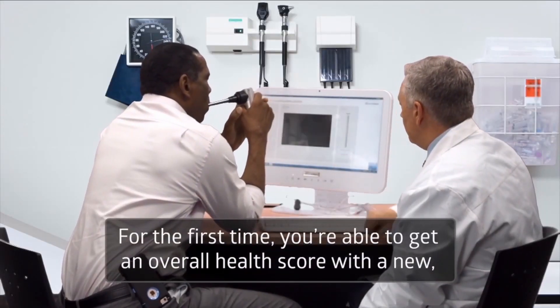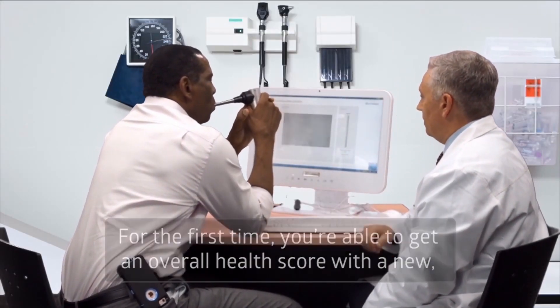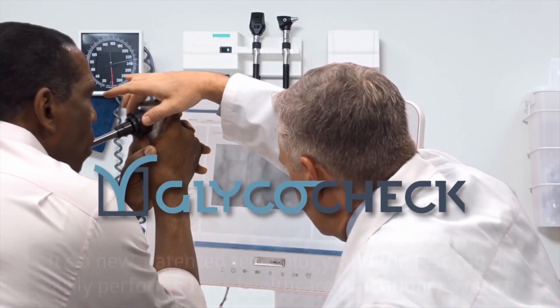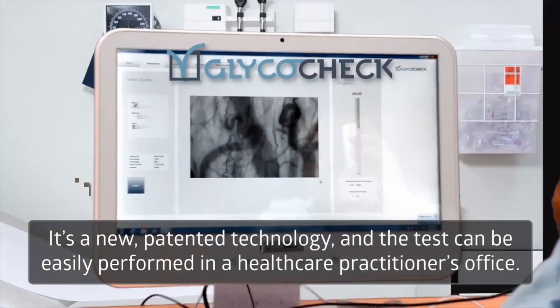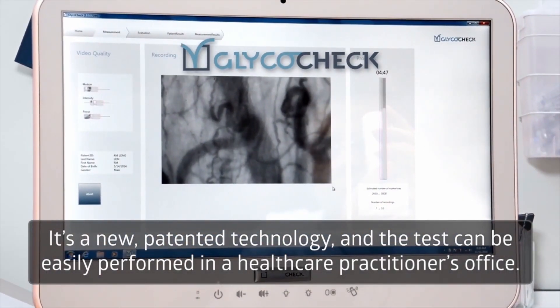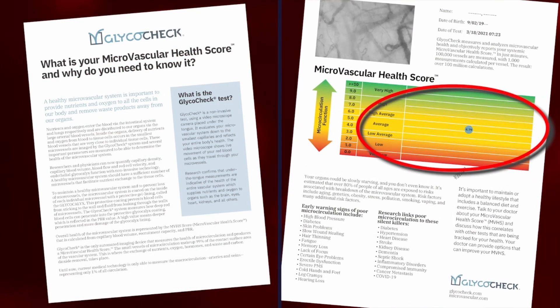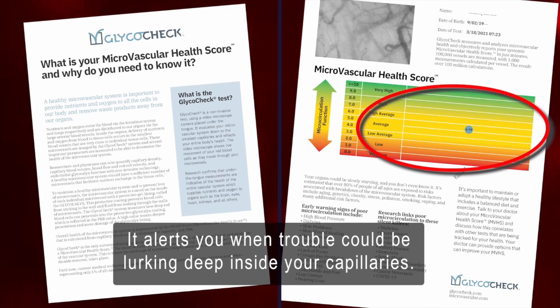For the first time, you're able to get an overall health score with a new, simple, and non-invasive test called GlycoCheck. It's a new, patented technology and the test can be easily performed in a healthcare practitioner's office. GlycoCheck gives you and your healthcare provider one single number — a microvascular health score — that alerts you when trouble could be lurking deep inside your capillaries.